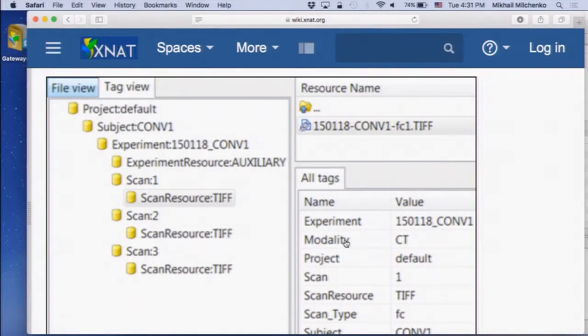Can this be automated? You have to run it through the desktop? Can you script it somehow? So the only part that you need to script is this XML document. The rest you run through the GUI.